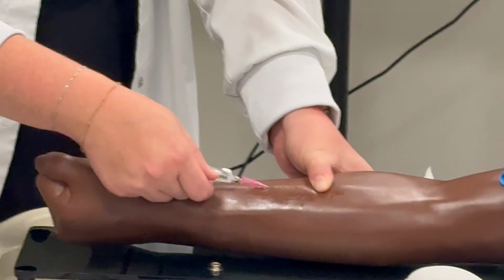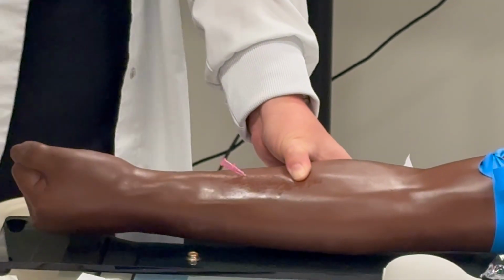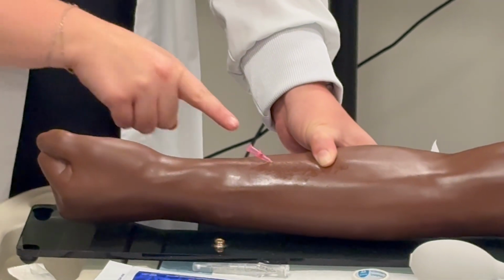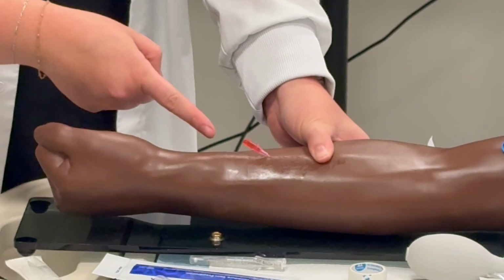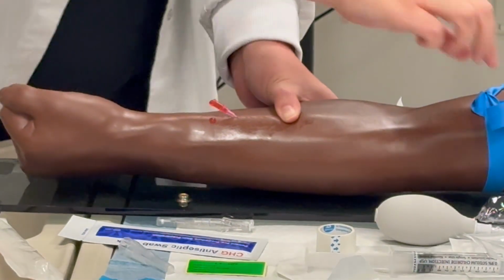I'm gonna press my button. See how it disappeared? The needle's in here, can't touch me anymore. Oh, you see my blood return coming? You can see it right there, see it? Okay, so this is gonna start leaking like this. So you wanna keep your thumb here. This is why we set this up before.